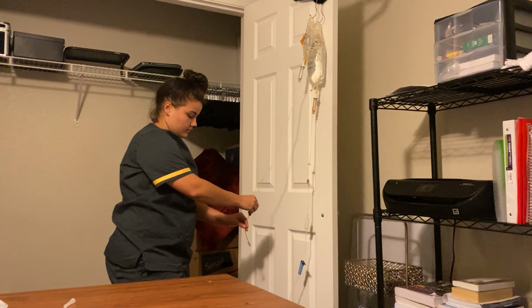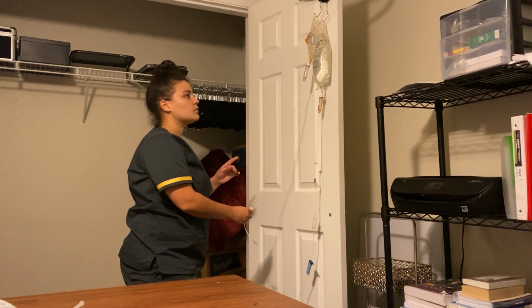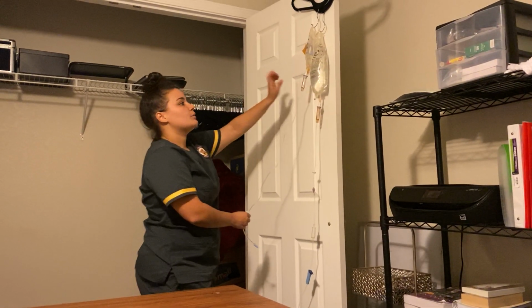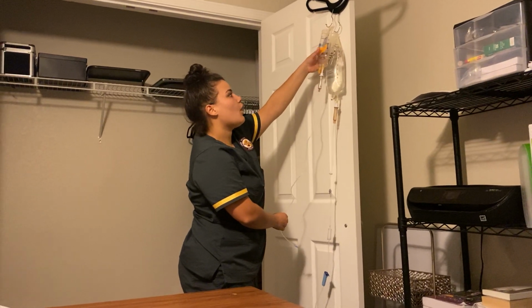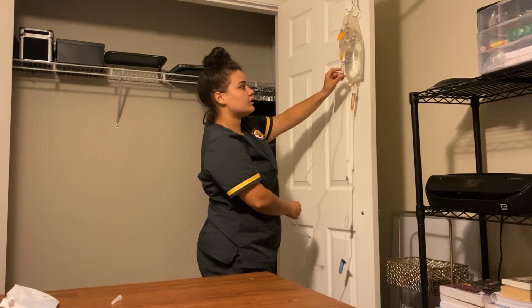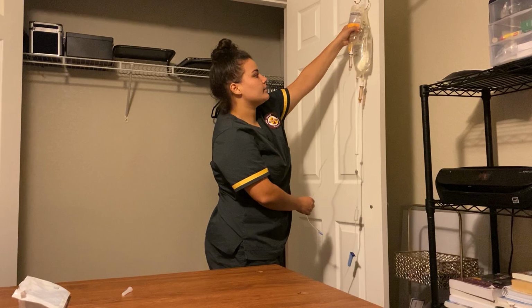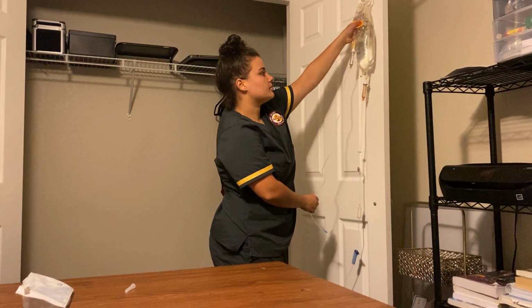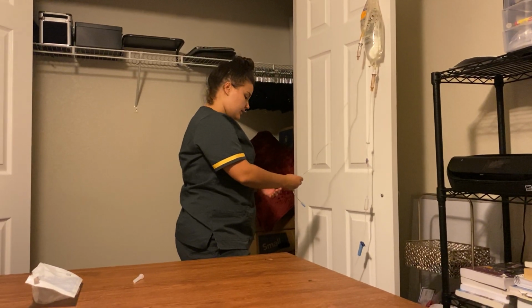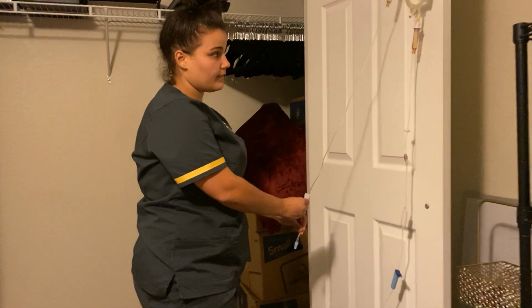Now, when you go to do this, also, I forgot to mention one thing. When I went to spike it, I hold this and I fill it up halfway. I fill it up halfway in the chamber. So I'm going to just hold it and I'm going to fill it up halfway. Halfway. Okay?